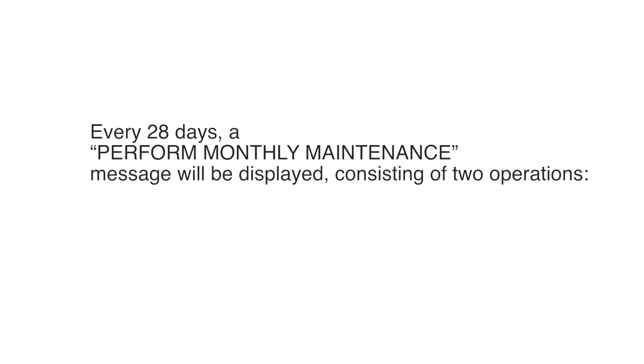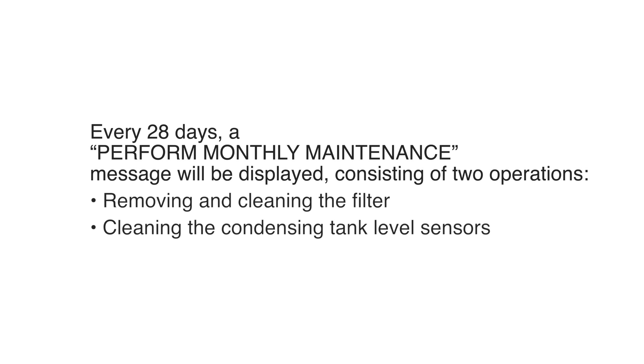Every 28 days, a 'Perform Monthly Maintenance' message will be displayed, consisting of two operations: removing and cleaning the filter, and cleaning the condensing tank level sensors.